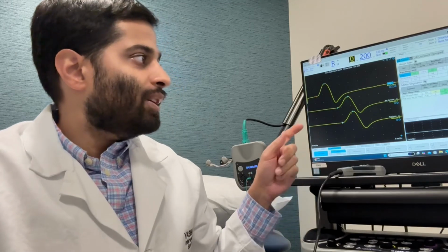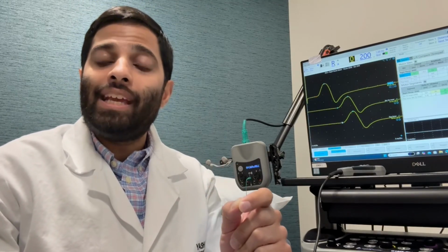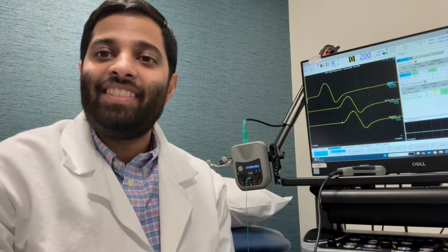The other thing that we can see, which I don't have a great picture of here, is when we're doing the needle portion, we're able to see how healthy is the muscle recruitment and the muscle activity. So when the nerve sends electrical activity to the muscles to actually fire, how healthy is that signaling, right? And how healthy is the response? How is the nerve working? How is the muscle working? How are they working together? Is the nerve really struggling and so the muscle has to pick up some slack, or is there an issue with the muscle and so the nerve has to work hard? Those are all factors that we're able to assess based on the NCS and the EMG.